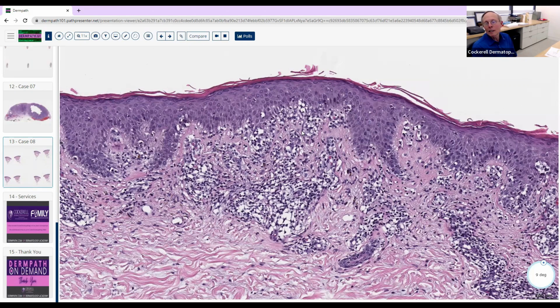They wouldn't expect you to recognize that on the board unless they showed you a clinical photograph. What if I told you this came from the back of the neck of a, say, 55-year-old guy that had worked out in the sun, and every time he went out in the sun, he got a horrible reaction, mainly in the sun-exposed areas. And biopsy, it looked like this, and it had been going on for 30 years. Like the rhomboid neck? Oh my gosh. Actually, chronic actinic dermatitis, chronic photodermatitis can look just like mycosis fungoides.